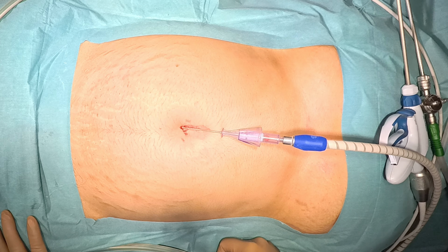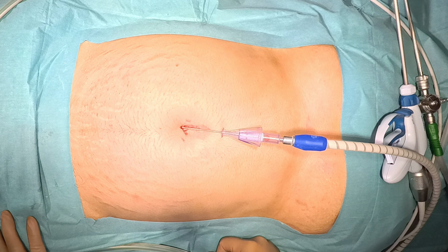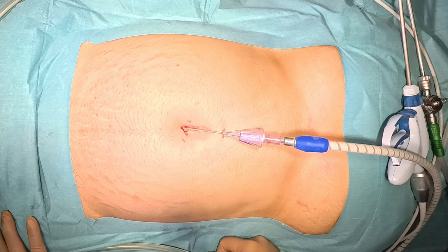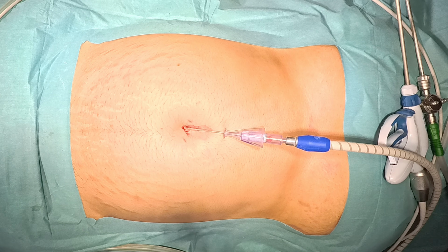So, this is cholecystectomy and appendectomy, and both we will perform with the same port. We can see now the bulge of the abdomen is appreciated and the actual pressure has almost reached the preset pressure, and now we will remove the Veress needle.